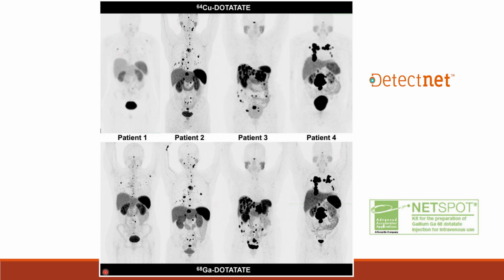So copper is going to have, this is the same patient, by the way. So this is patient 1, top and bottom with both drugs. This is patient 2 that got both drugs. Patient 3 that got both drugs. Yeah, you get it. So in patient 2, I want you guys to look at patient 2. See how this is the exact same patient, but you have a lot more spots showing up with the copper.